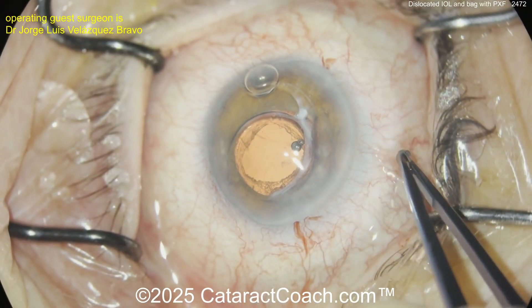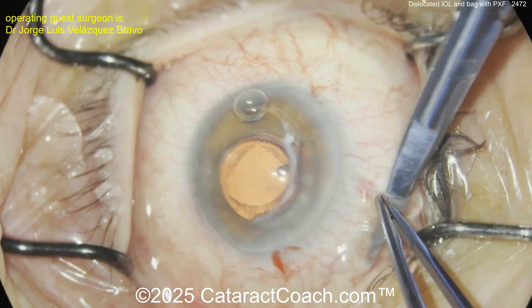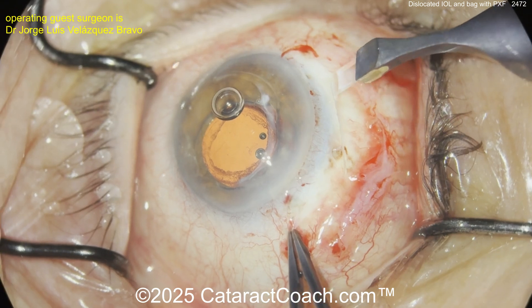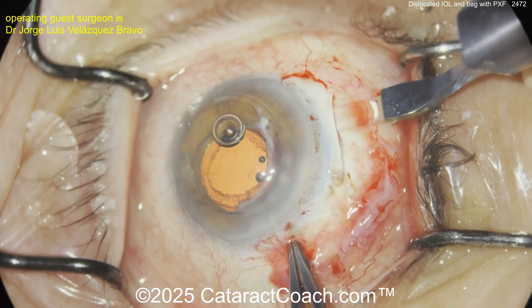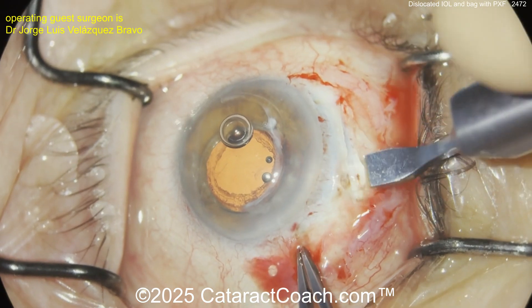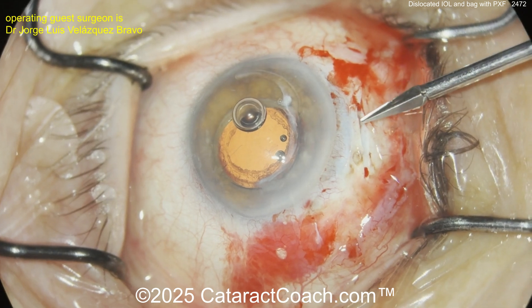Would you cut it in half, or do a twisting-out technique? Let's see what the surgeon is going to do. Looks like they're making a groove here — half scleral depth groove — perhaps going to be a wide incision to take the lens out whole. I like a scleral tunnel; that's always going to seal up really nicely with great long-term stability. That's a pretty wide scleral tunnel — you only have to make it about six and a half millimeters.